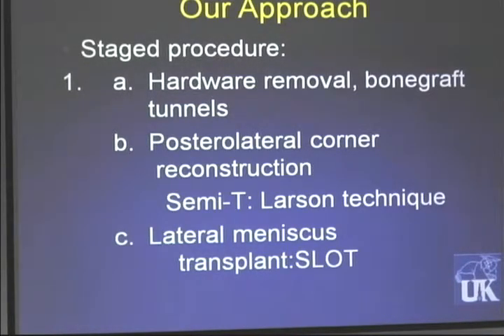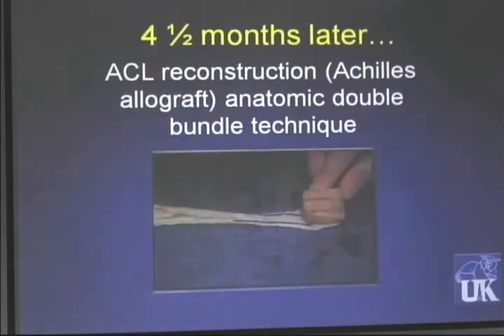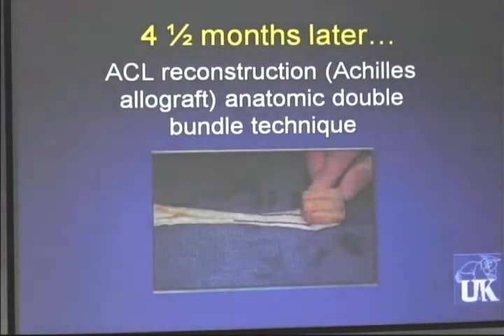So took out her hardware, bone grafted her tunnels, and I started over. So we reconstructed her posterolateral corner. I also put in a lateral meniscus. So here's when I went in. So here's her lateral side. Okay, here's her graft. Here's her lateral meniscus. And I bone grafted this tunnel. And then 4.5 months later, I took her back.